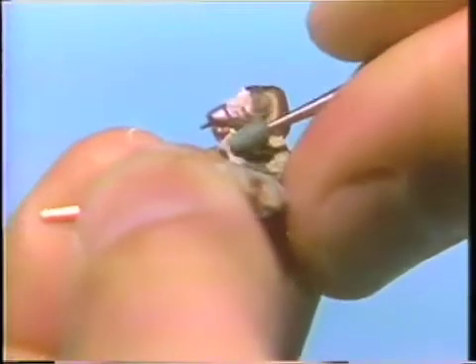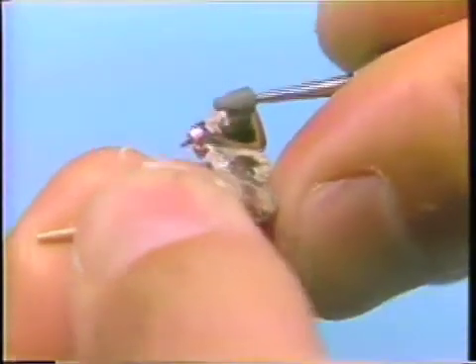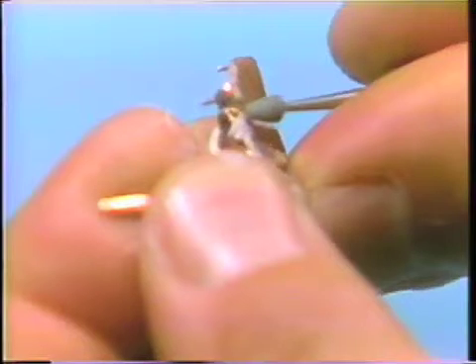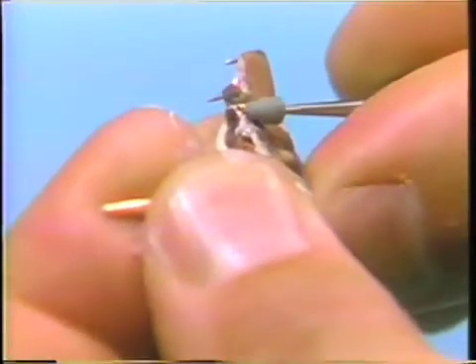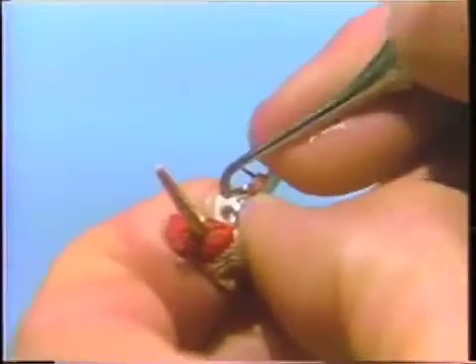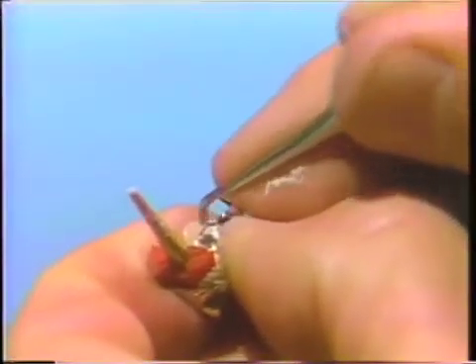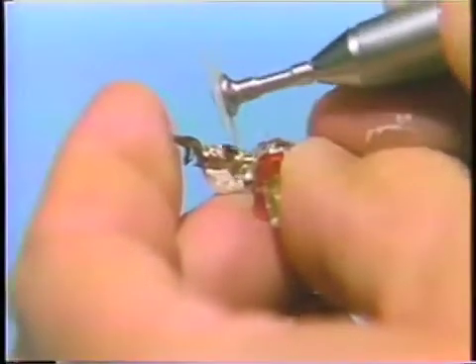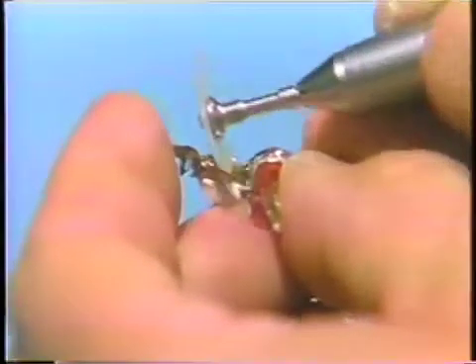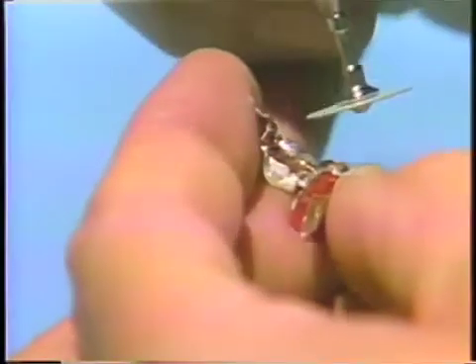Here we are using a green stone to cut the platinum pins down to the gold surface, going from platinum to gold. This rivets the gold and the platinum together. Then a 5S burnisher is used to burnish the gold margins and the incised ledge. A sand disc is then used to finally finish the platinum and gold margin on the lingual surface where the pins come through.